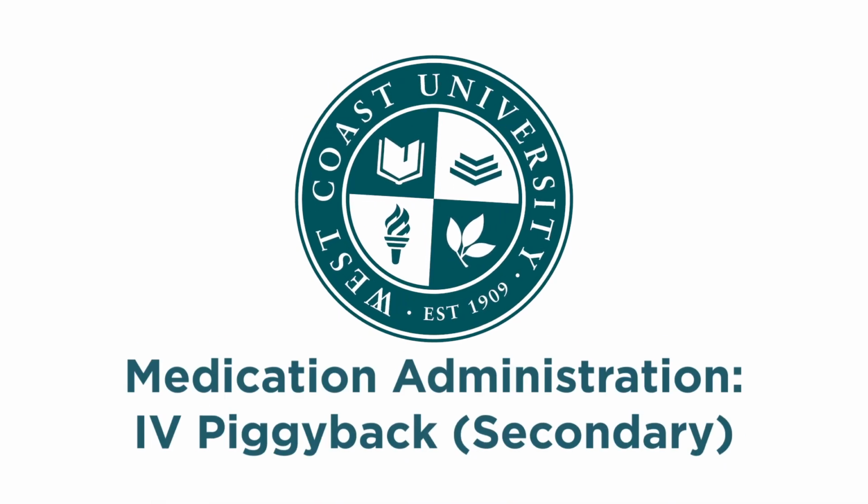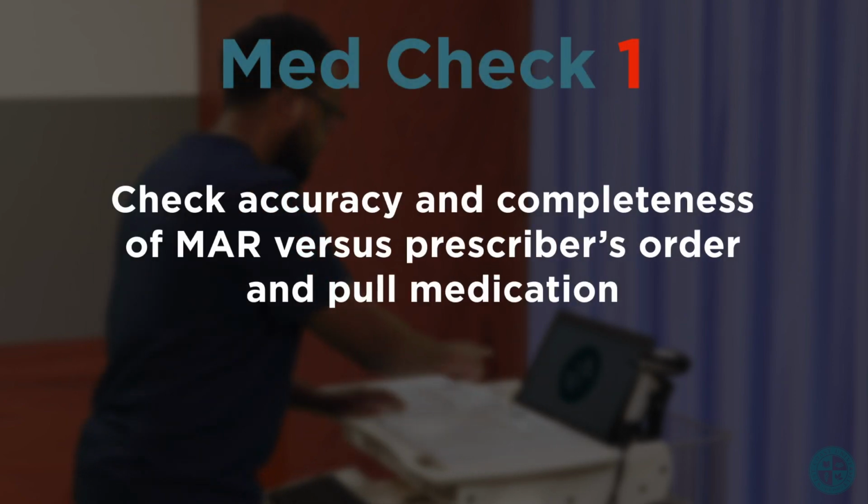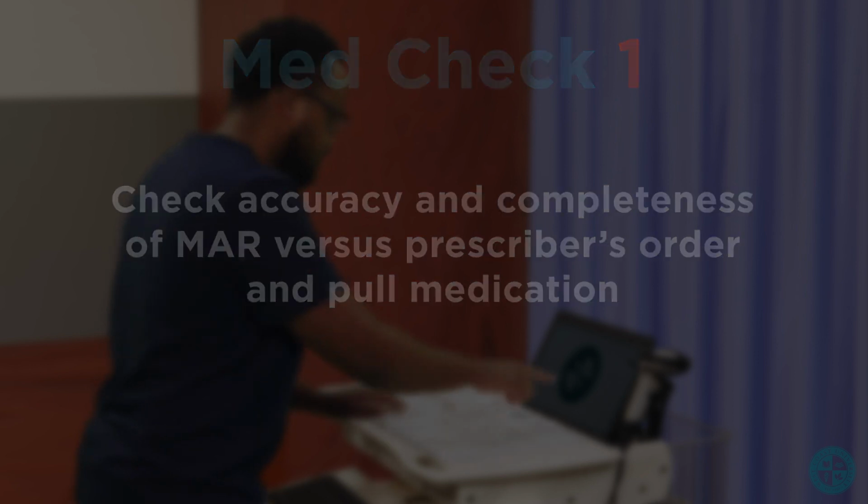Medication administration, IV piggyback, secondary. Med check 1. Check accuracy and completeness of MAR versus prescriber's order and pull medication.